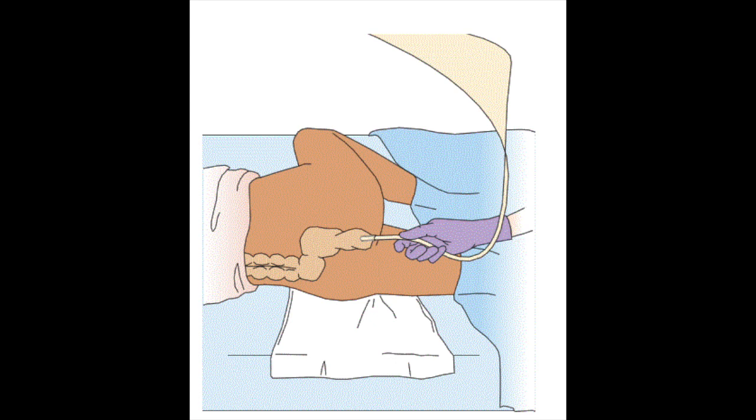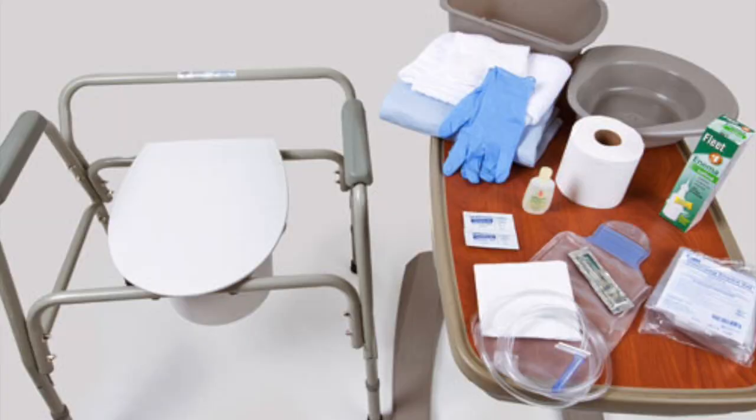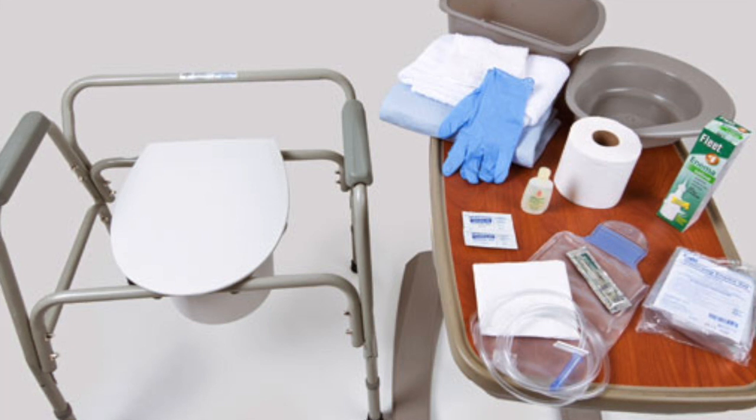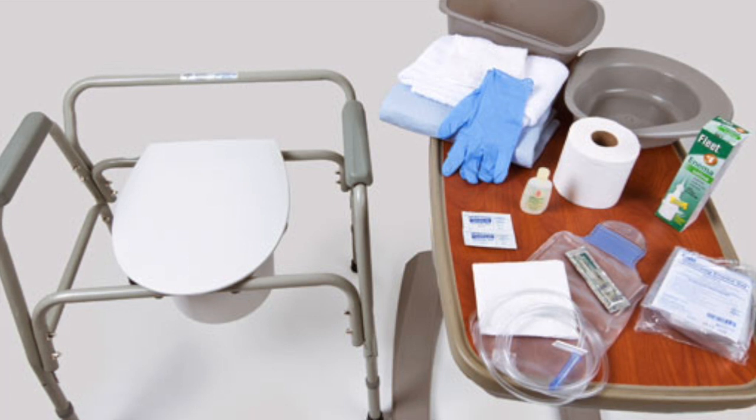The next step is to administer the enema. In this case, we're going to be doing a prepackaged disposable enema. Remove the plastic cap from the tip of the container and apply water-soluble lubricant as needed. Next, gently separate the buttocks and ask the patient to relax. Expel any air from the enema container and insert the lubricated tip into the anal canal toward the umbilicus. For an adult, insert the lubricated tip approximately 7.5 to 10 centimeters.